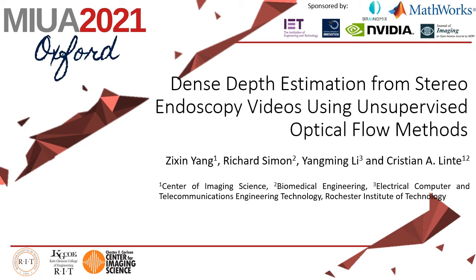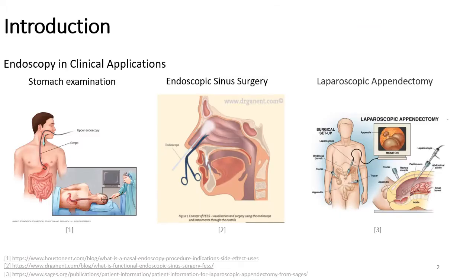I'm going to present our work, dense depth estimation from stereo endoscopy videos using unsupervised optical flow methods. Endoscopy is a tube-like camera with a lighting source on its end. It has varied applications such as stomach examination, sinus surgery, and appendectomy surgery.